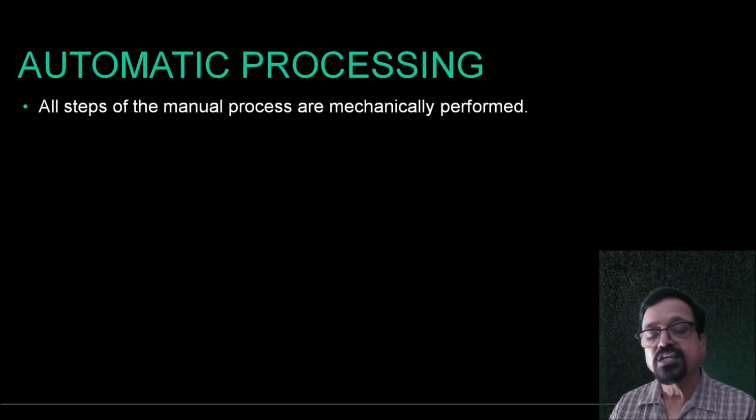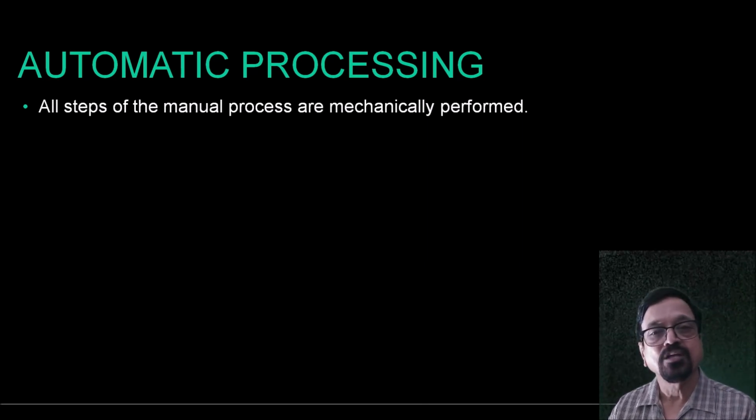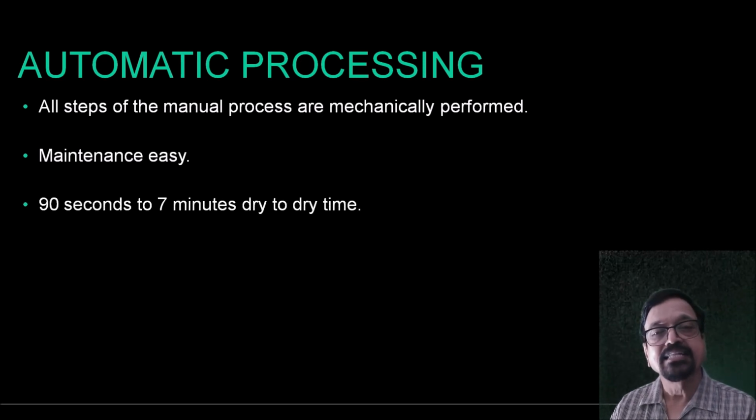Now, all steps of manual processing are mechanically performed. So there is not much difference in chemical reactions between automatic and manual. Then maintenance is easy. There is no rinsing in an automatic processor.